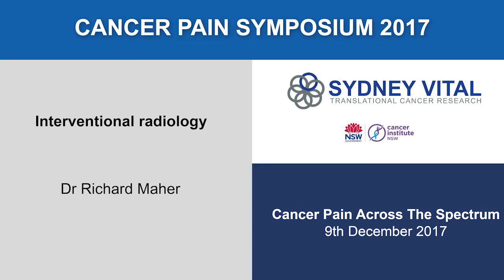Just a quick slide on cryo. It's a similar technique: as an interventional radiologist, it's basically sticking a probe in using image guidance, and most of us would use CT guidance or ultrasound guidance depending on how superficial it was. There are cryoablation MRI-compatible systems now, which is very helpful because a lot of tumours, for example renal tumours, you can't see very well on other imaging modalities. Obviously the infrastructure cost of setting up MRI-compatible cryoablation is very large.